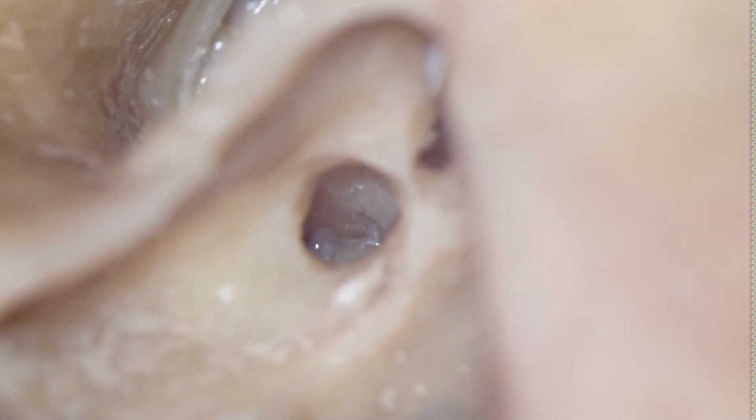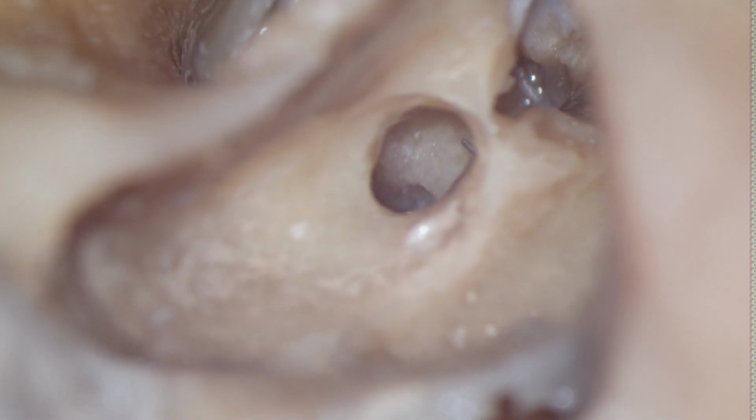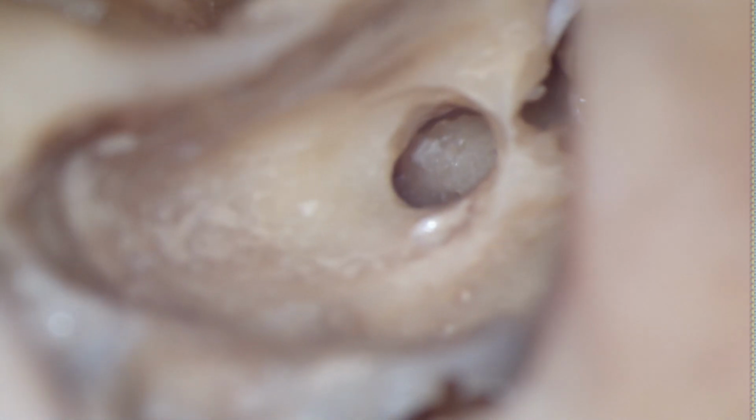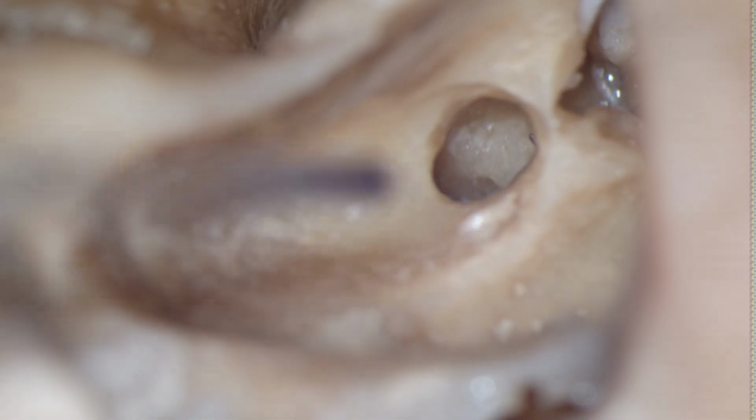Okay, so this is a round window. Or can we see the oval window? No, wait a minute, there is confusion. Okay, can you see the round window here? This is a round window, and yeah, so round window niche.